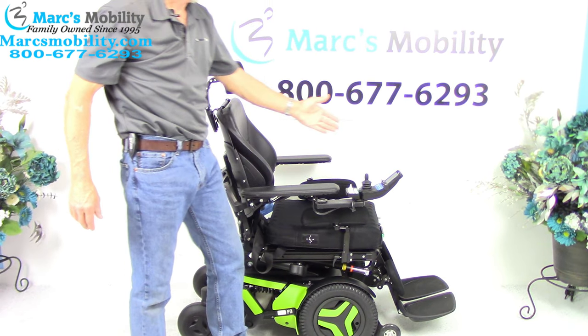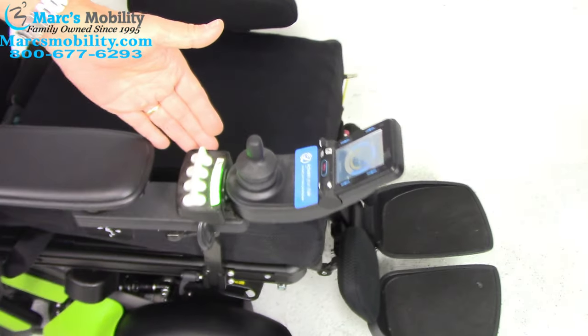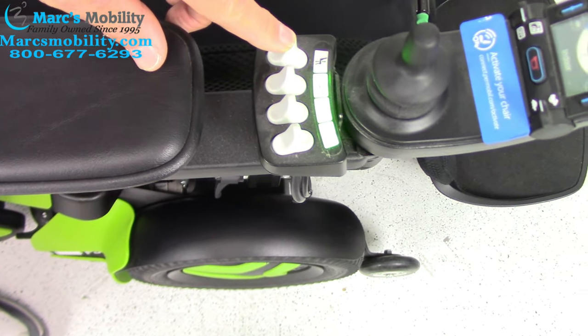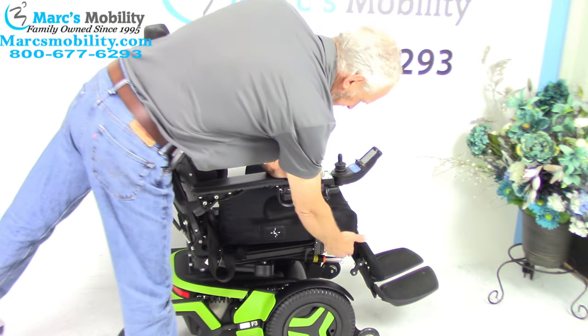All the functions on this chair need to be worked through the joystick or through the switch box. I like to use the switch box — it's quicker for me. As you can see, the first button is not lit up, so that means there's no seat lift. So we're going to go to the second button, pull it back. This is called the electric tilt.